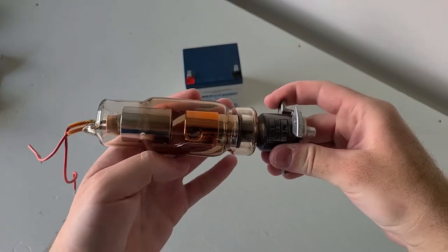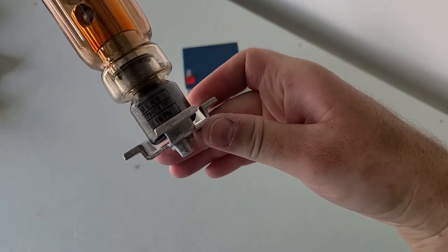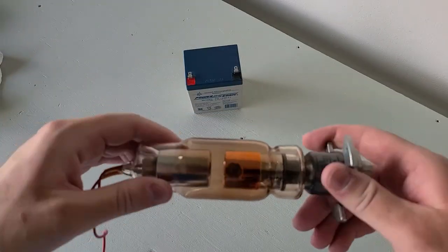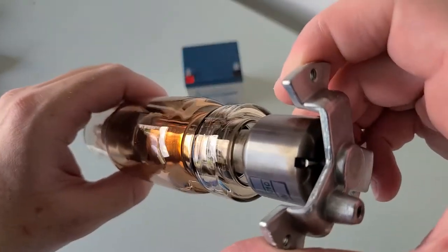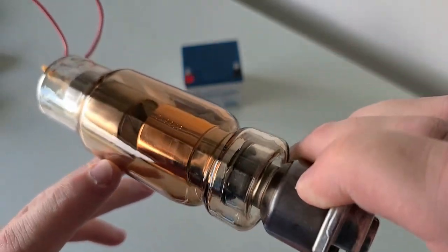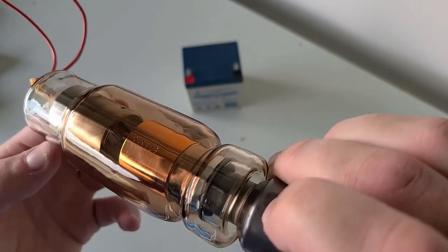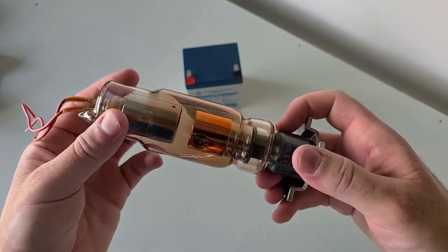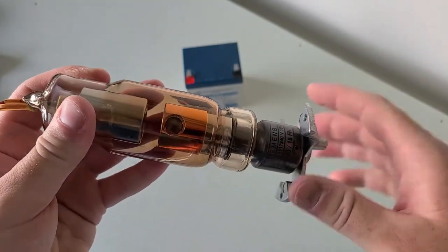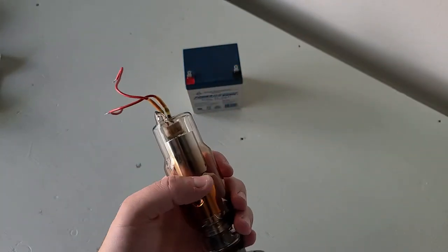All right, so here I have the tube all cleaned up. Again, this is an old Siemens Panorex tube. It's very small, doesn't use a lot of kV or mA. I'm looking closer at it in here. That's where your filament is, right inside here. Let's see if we can get a shot there. You can kind of see it right through there, the tiny little filament. And then this is the cathode side and the anode side. You have a little focusing window here in the anode. These are just the two cables that went to the cathode side.